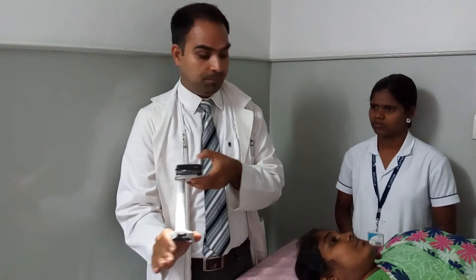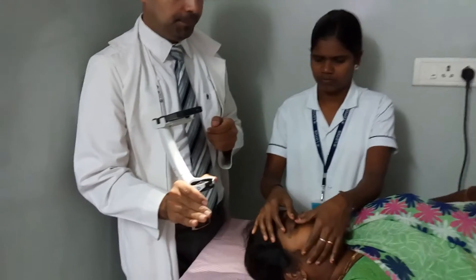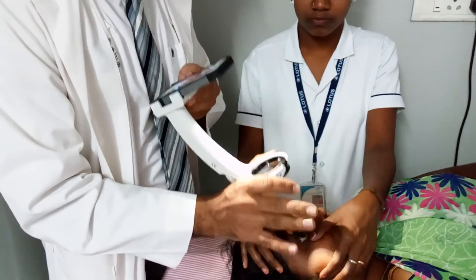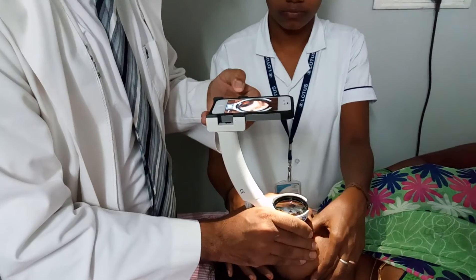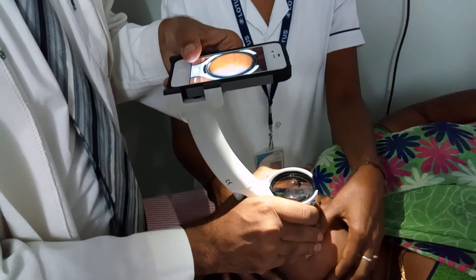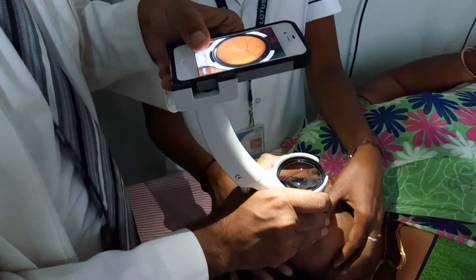The other hand clicks the image. I'll request my assistant to open the lid. In a similar manner, support these three fingers on the patient's chin, go down, and keep coming up. Now you can see I am very, very stable.